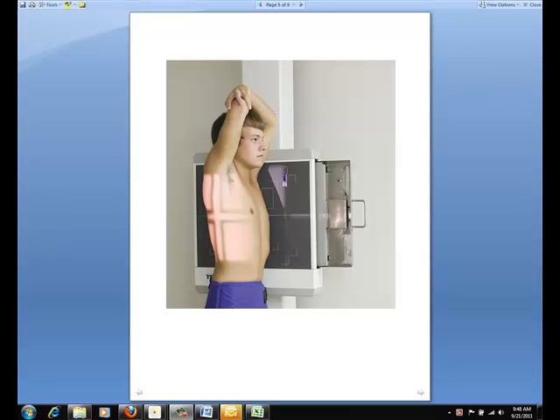For the lateral projection of the chest, once again, we want to ensure that we have a minimum SID of 72 inches to decrease the magnification of the heart and increase the recorded detail of the thoracic structures. When positioning the patient, turn the patient into a true lateral position. Most commonly, use the left lateral position with the patient's left side against the IR.